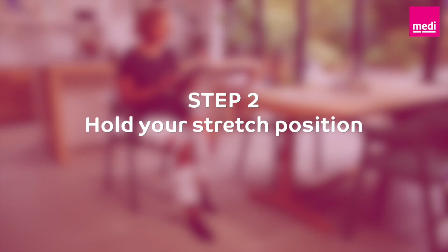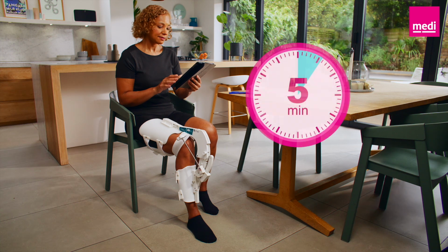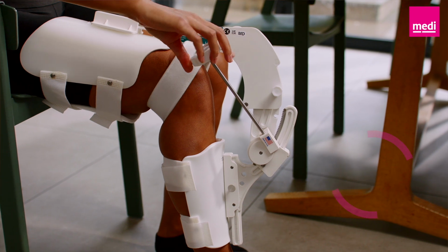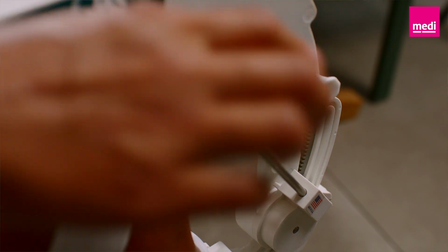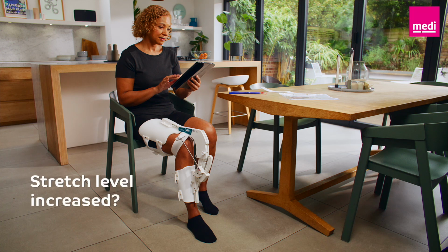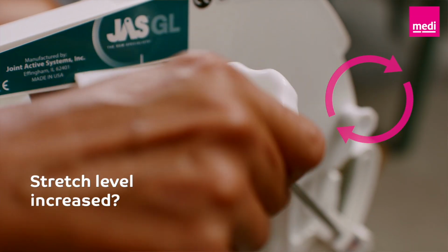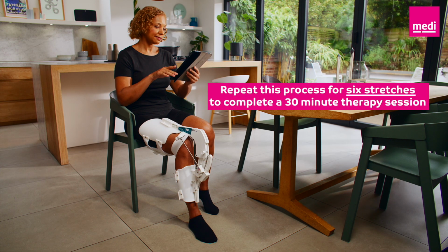Step 2. Hold your stretch position. Hold your gentle stretch position for 5 minutes. Once this time is up, pause and check the following. If your stretch level has reduced, turn the therapy knob until you feel a level 2 or 3 stretch again. If you feel no change in the stretch level, leave the therapy knob in the same position. If the stretch level has increased, rotate the therapy knob in the opposite direction to lower your stretch back to a gentle level 2 or 3. Repeat this process for 6 stretches to complete a 30-minute therapy session.